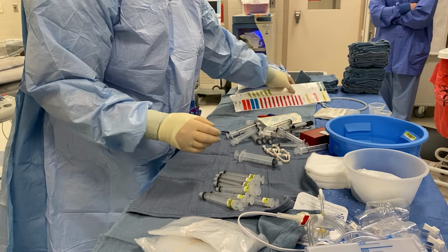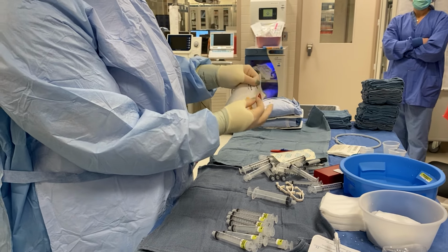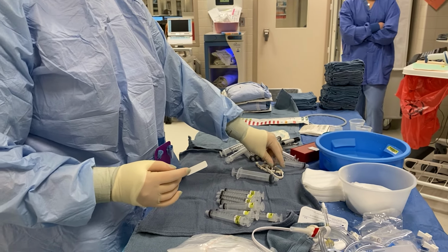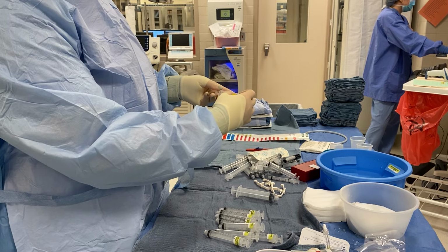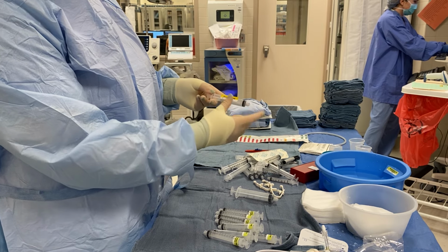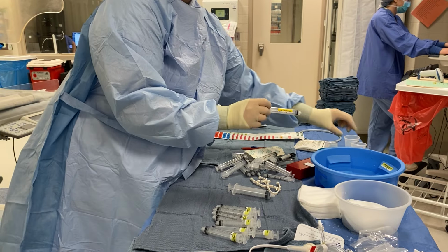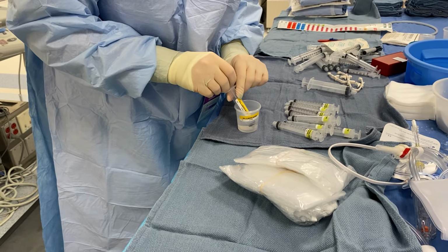The next syringe we're gonna label is gonna be our lidocaine syringe. So I still have one more 2% lidocaine. And then usually what I like to do with any medication to identify it as a medication as opposed to saline, I'm gonna put the sticker on in the opposite direction so that everybody can clearly read it. And then I'm gonna draw up my lidocaine here. I'll draw up a full syringe.